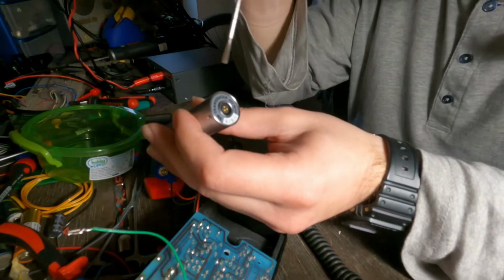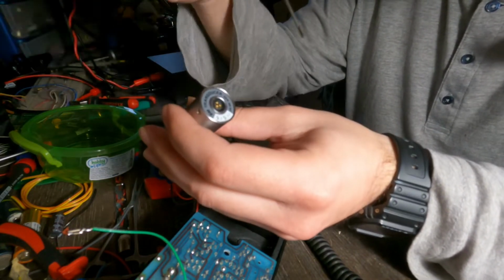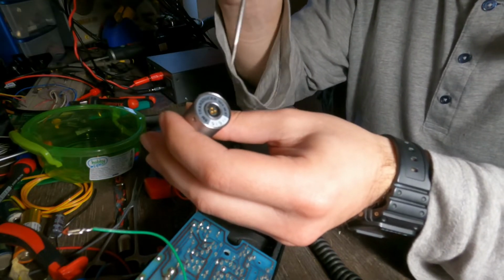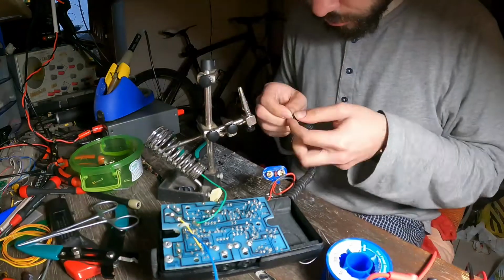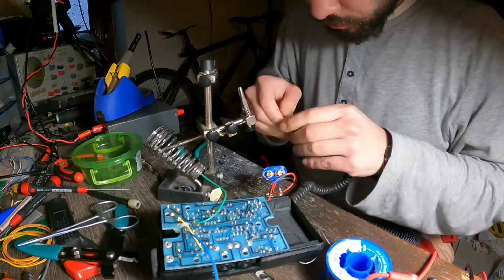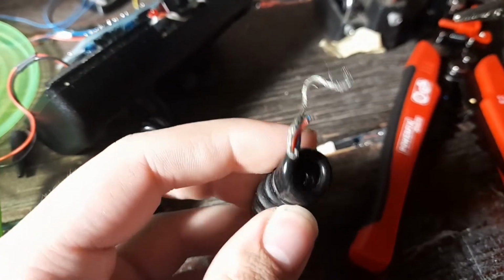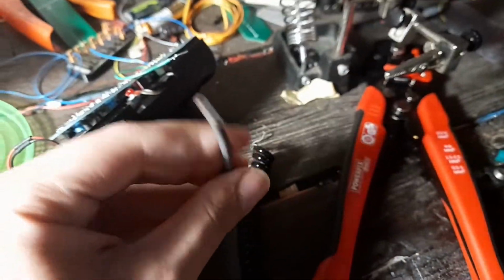I have to note here that the process that I followed to trace the voltage line assumed that there was no voltage regulator in this transducer. If a voltage regulator existed, then the approach would be different. The cable was in a really bad shape, so I decided to change it completely and replace it with a new one.